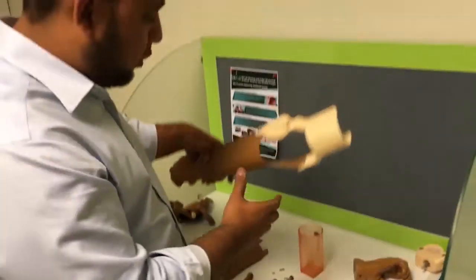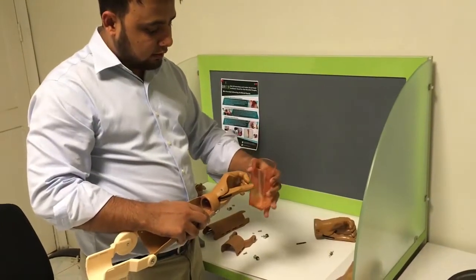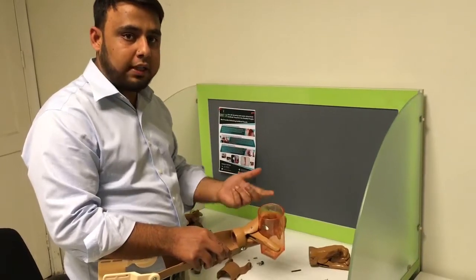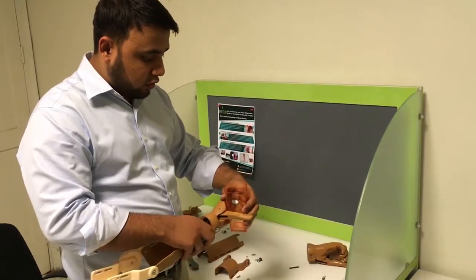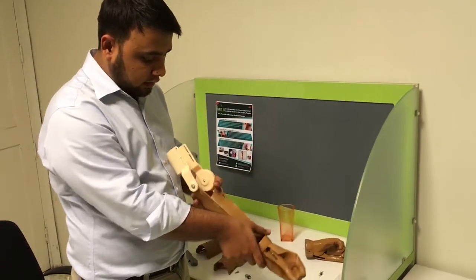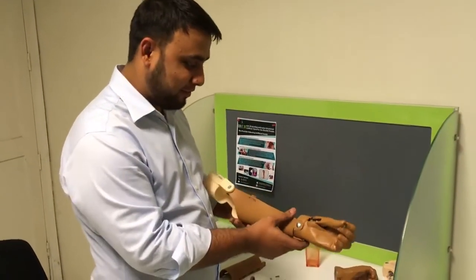This is the end product. You can see the gripper palm and how it works — you hold a glass, push it with the other hand, and you see it holds it. You don't need to apply extra effort to hold it; you can hold it for an hour and you won't get tired. You can remove it easily, and you can carry water with it. So this is the end product — the forearm, the palm, and the cuff. Thank you.